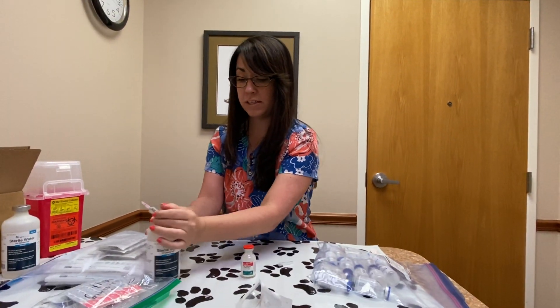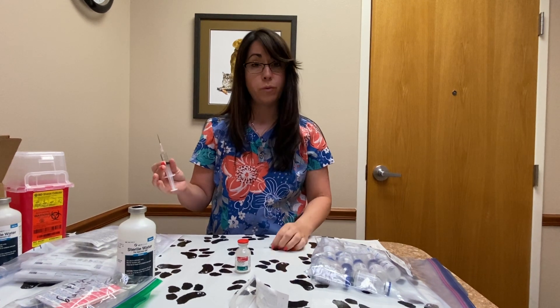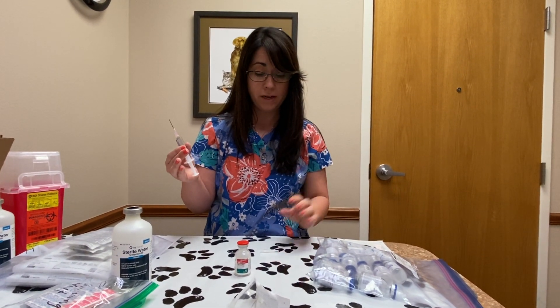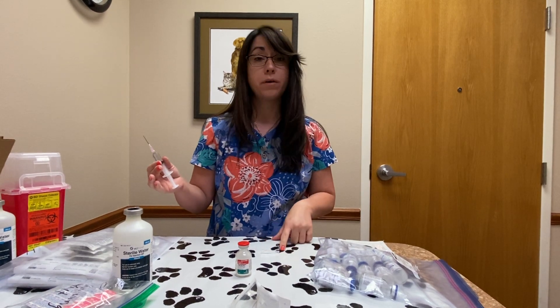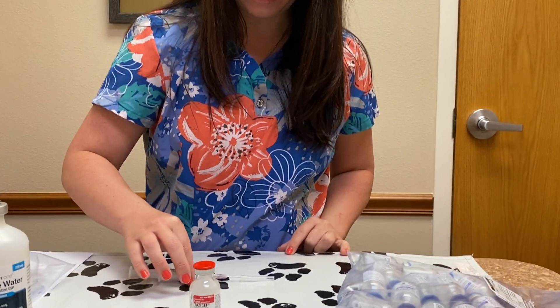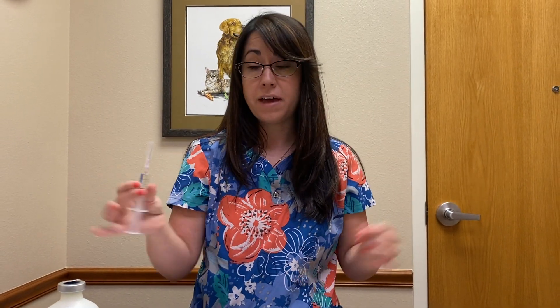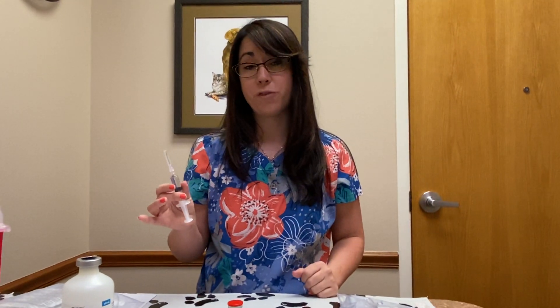Close this and set it aside. If you need to recap your needle at any point, for everyone's safety use the single-handed method: lay your cap flat on the table, cover the needle with one hand, and once it's safely covered then finish recapping your needle. The reason for that is doing it the other way is the easiest way to poke yourself, and that hurts.